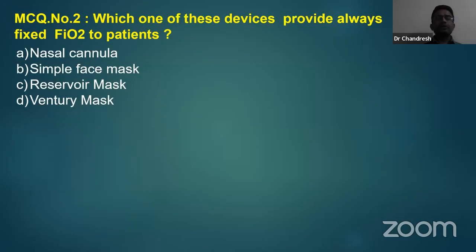Now another MCQ: which one of these devices always provides a fixed FiO2 to the patient? Is it a nasal cannula, simple face mask, reservoir mask, or a Venturi mask? Let's see what answers we are getting from our audience. Many of the people have answered D, Venturi mask.